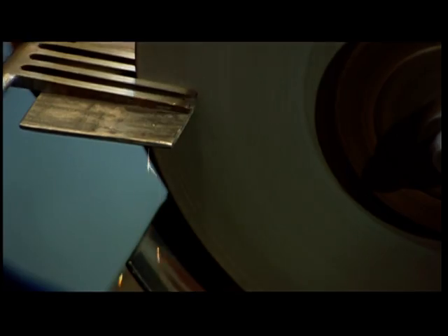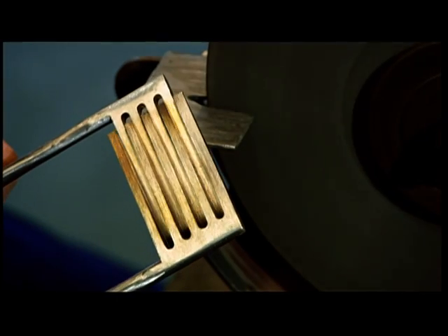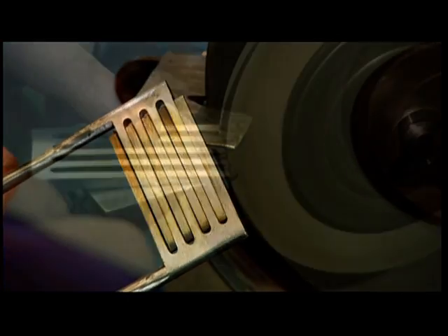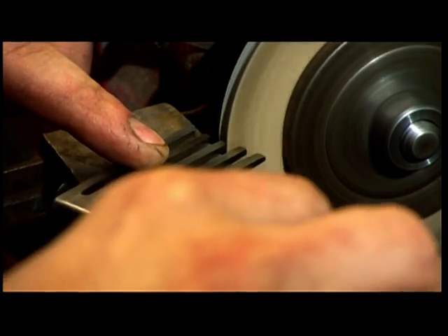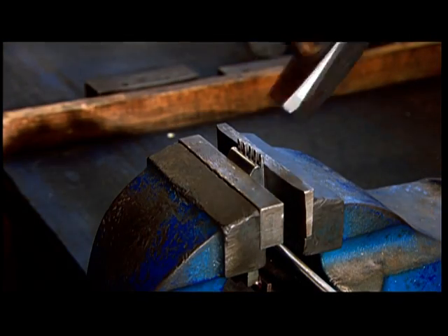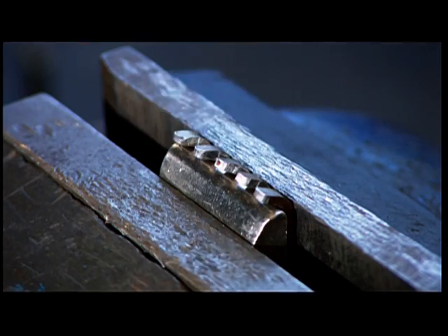He then smooths the jaw's teeth against a fine grit wheel so they'll easily intermesh when needed. He rounds the tips of the teeth to make them blunt so they won't damage human tissue. He hammers back the tips of the teeth, giving them a claw-like profile.